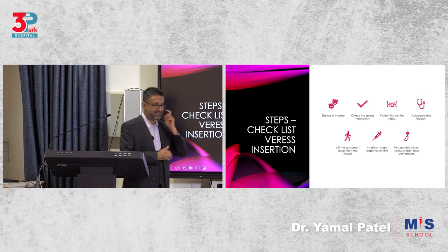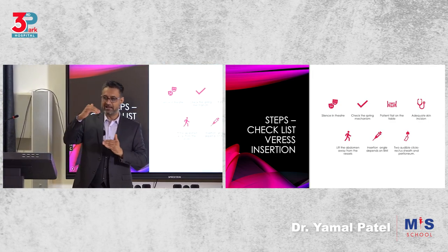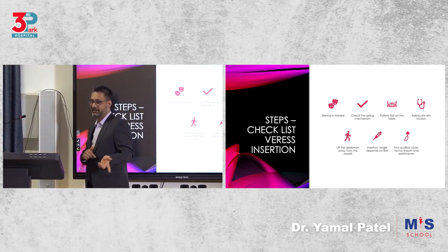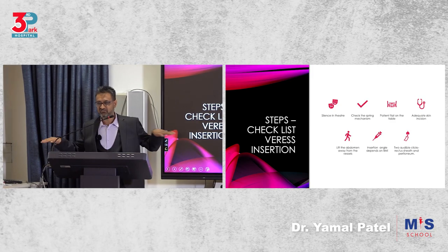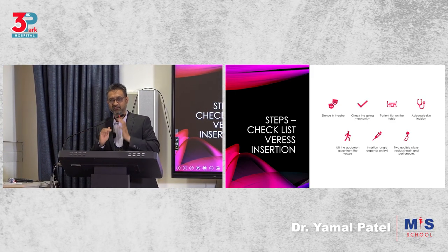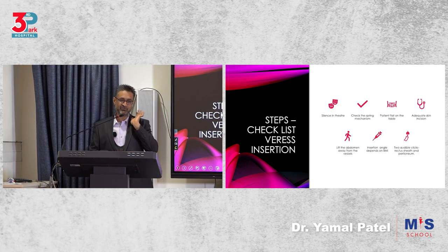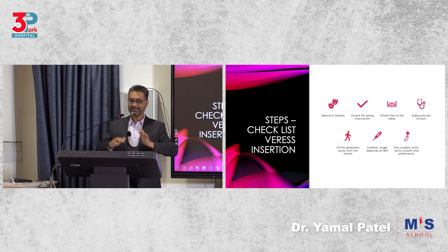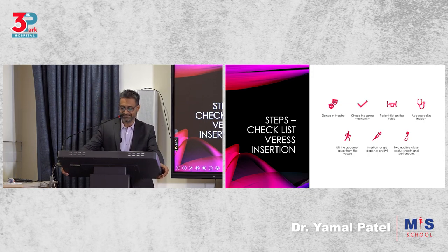The patient should always be flat. Do not try to enter when the patient is already in Trendelenburg. Your direction will take you towards the aorta or vena cava in that position. So the patient has to be flat for initial entry. These are rules, ideally not to be broken. With experience, what you do is up to you, but for initial beginners, these are rules not to be broken. Make a good small incision.